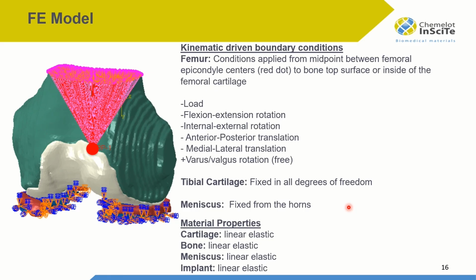For the finite element simulations, we are using kinematic-driven boundary conditions, and these boundary conditions are applied to the femoral epicondyle center, which was identified by the Synopsys software. At this location, you basically apply load, flexion, extension, internal, external rotation, anterior, posterior translation, and medial lateral translation. In these simulations, we also leave valgus rotation free so that the knee aligns itself.